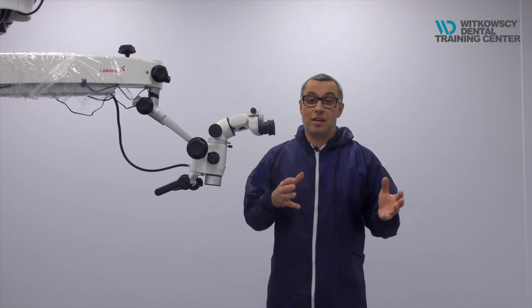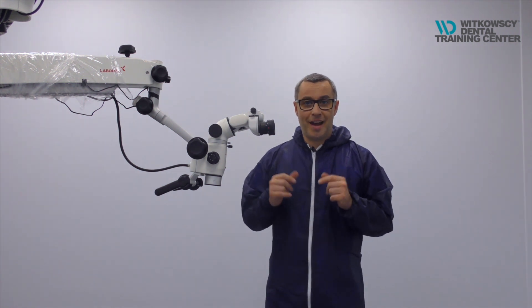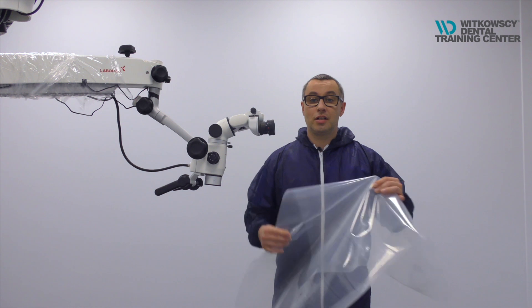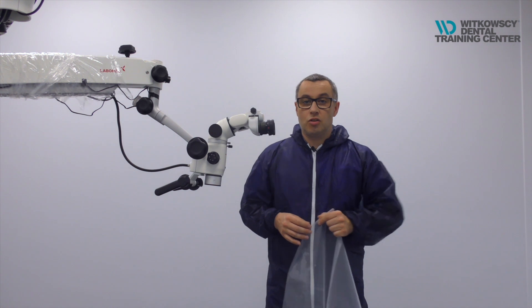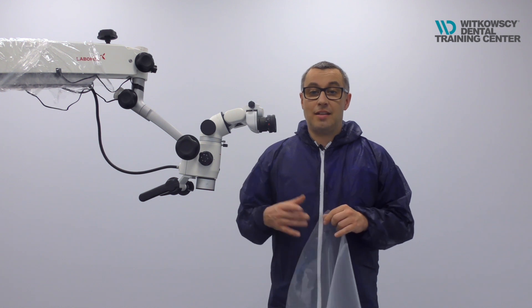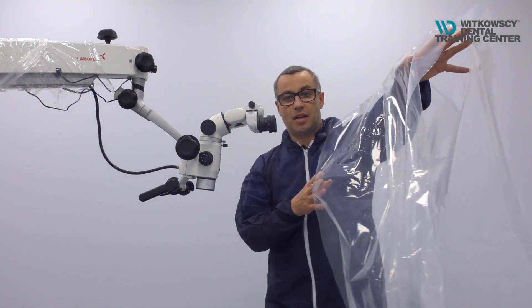Everything that you were doing before is now possible to do straight away, just after this short changing of the microscope setup. So what we need is a pot of a tube — this is not normal plastic, this is the plastic used for gardening. You need to find in your country a special store for gardening, and this store will sell you a plastic tube which is open from one side and another side.